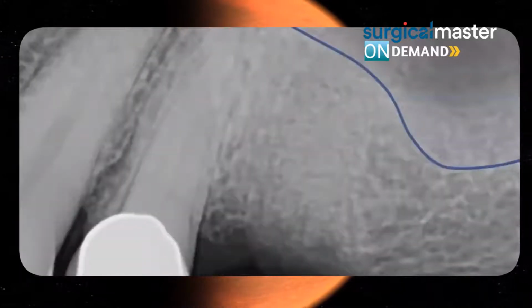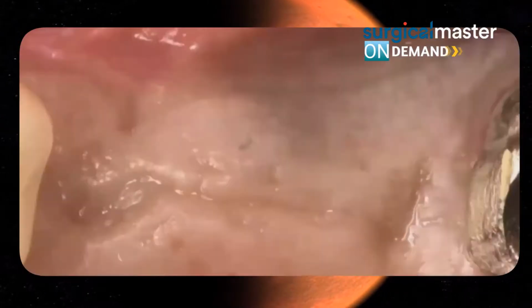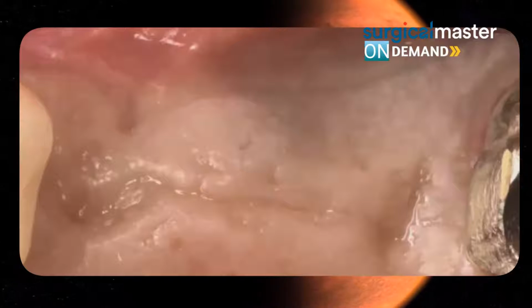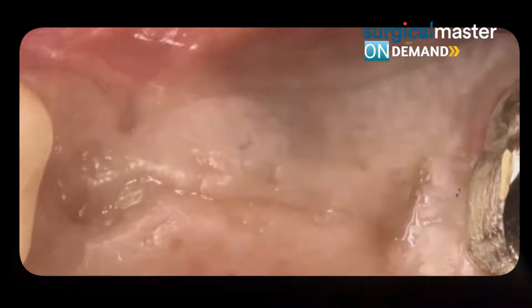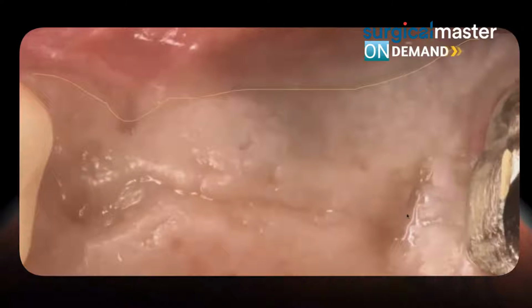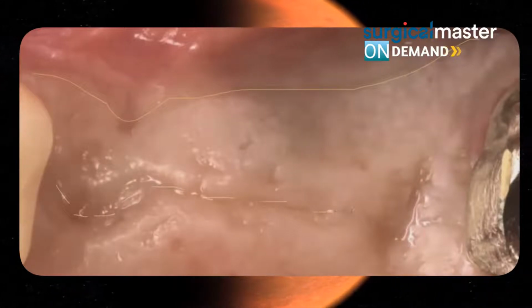Okay. So here's the planning. What's the strategy for this sinus lifting? Well, we're going to do that. Here's the site. I recommend when you look at the site, look at the soft tissue. Don't be dogmatic. The soft tissue is not always like what you see in textbooks. Sometimes they're not very regular. There's some scar tissue. There's certain levels of soft tissue. So I like to follow the scar. There's a scar here that was left from the extraction process. This is just how this patient heals.